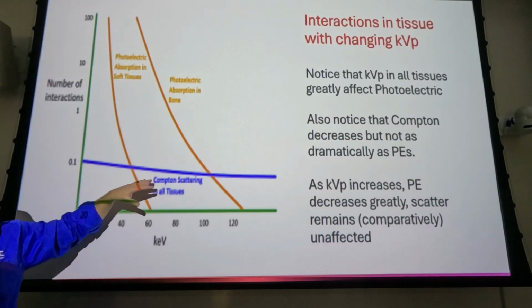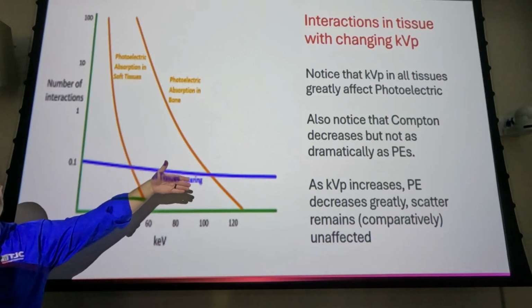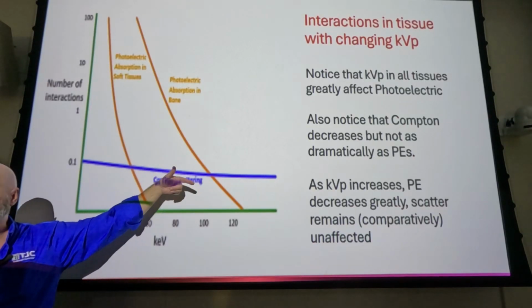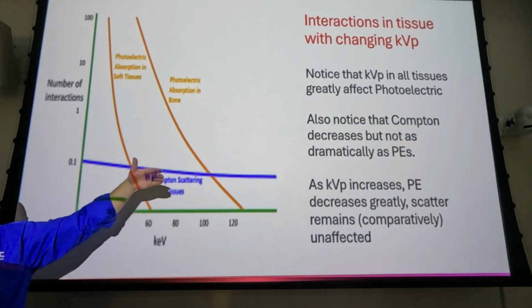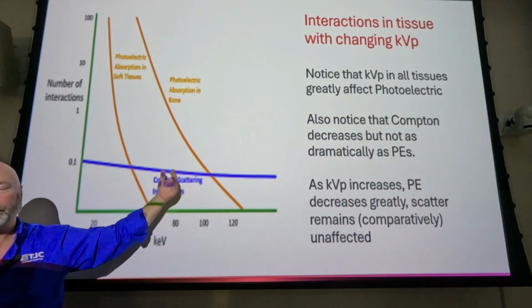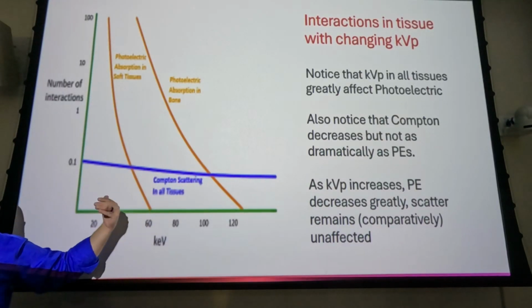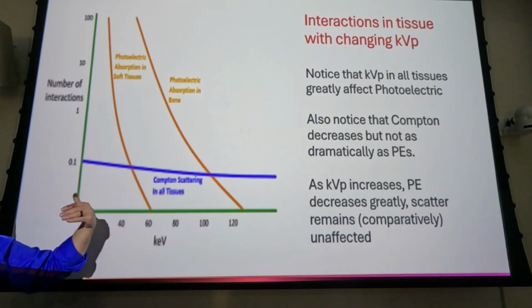So your scatter radiation will go on sometimes and penetrate, or it will eventually bounce around and photoelectrically absorb. That last interaction, photoelectric absorption, doesn't include all the scatter events that happened before. Does that kind of make sense? You all got that?